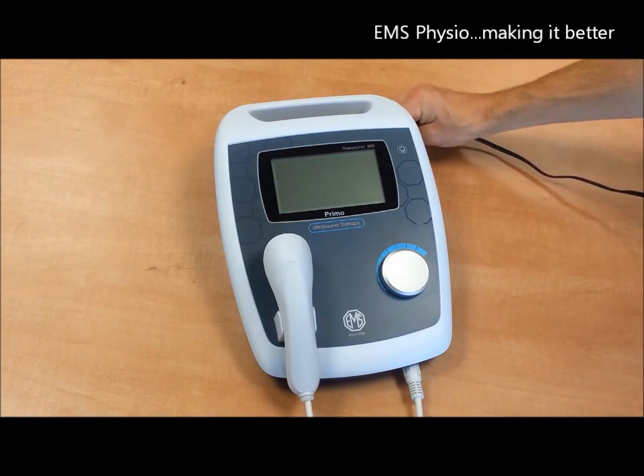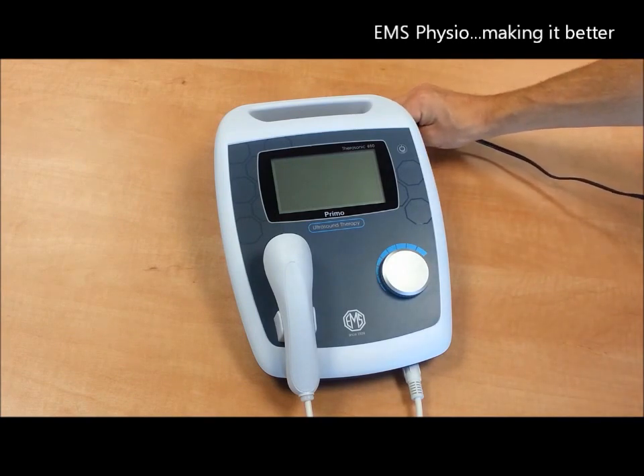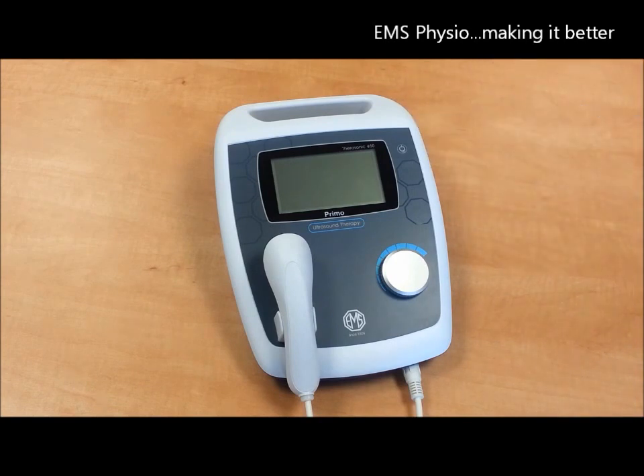It has been designed so it can be used with any mains power around the world without any modification. A battery option is available and you should indicate this at the time of ordering, as the battery should be installed by a fully trained technician.